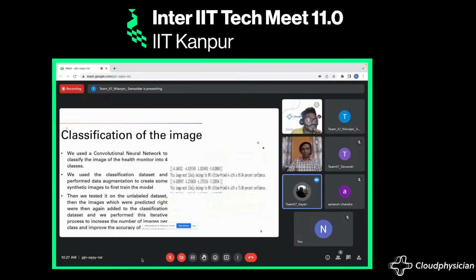Now for the classification of the image, we used a CNN model to classify the health monitor into four classes. We trained the model using the classification dataset and then used the unlabeled dataset to check the prediction accuracy or the correctness of the model. The correct predictions were then added to the respective classes. Now my teammate Devansh is going to explain this further.